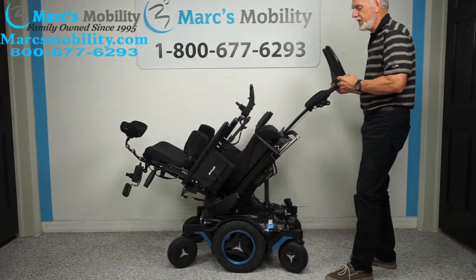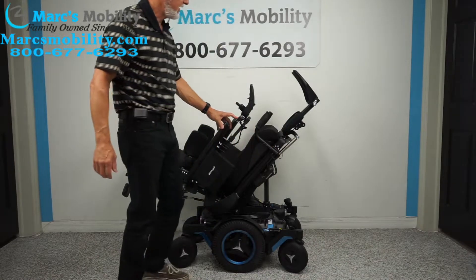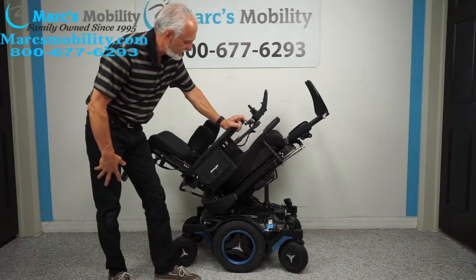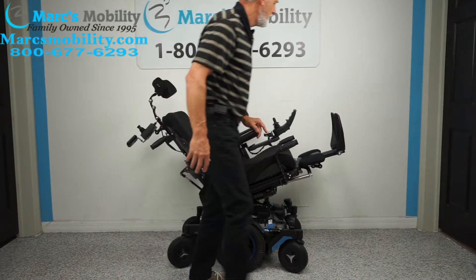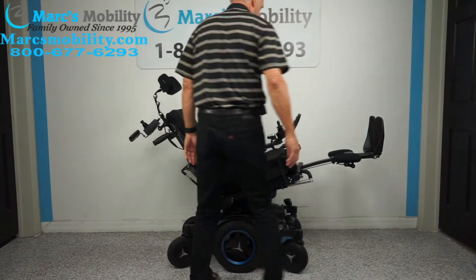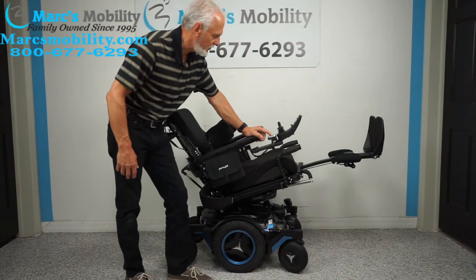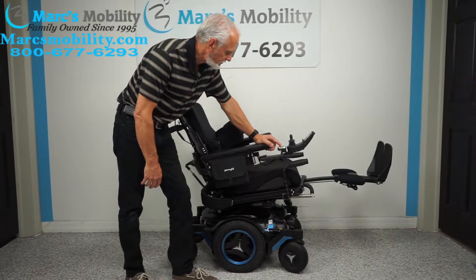If you're sitting in the chair this would stay here, but look — if we only go halfway tilted and bring the seat down halfway, your feet are still higher than your body. Notice that — so you don't have to be tilted all the way back to get good circulation in your legs.